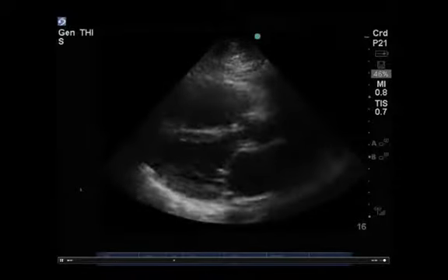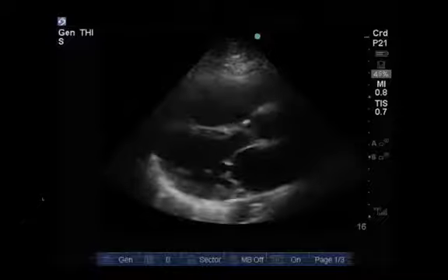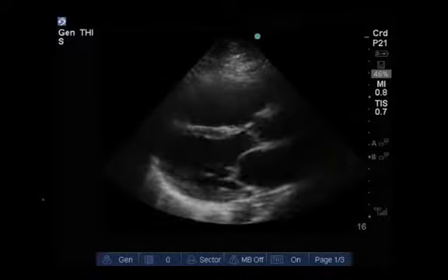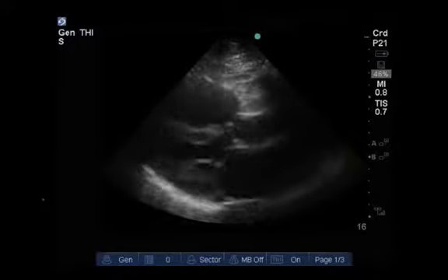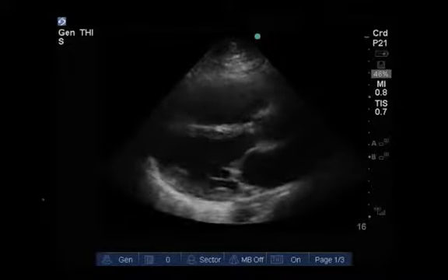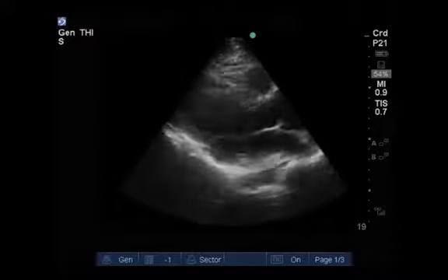This is not diagnostic of mitral stenosis. That requires spectral Doppler techniques typically to address its severity. But again, this eyeball technique will serve us well in pattern recognizing obvious anatomic distortions to the valves prior to going any further with other techniques.